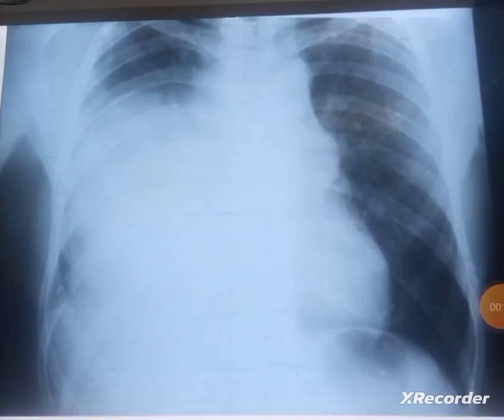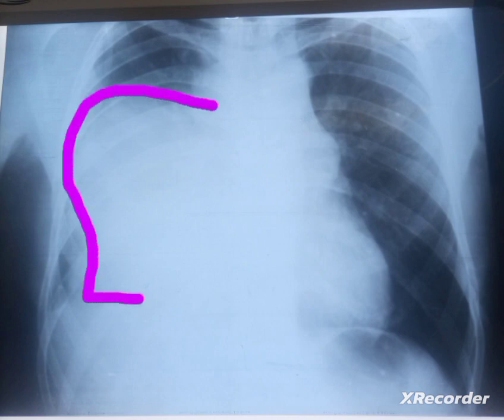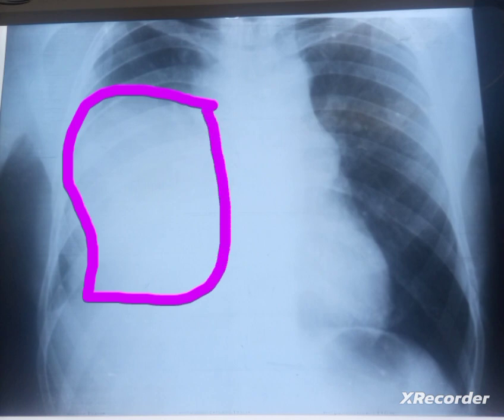This is Dr. Jangir, and you're watching my YouTube channel. Today we are going to discuss another very important chest X-ray. If you focus on this chest X-ray, you can see there is a homogeneous opacification of the right mid to lower zone, sparing the costophrenic angle.